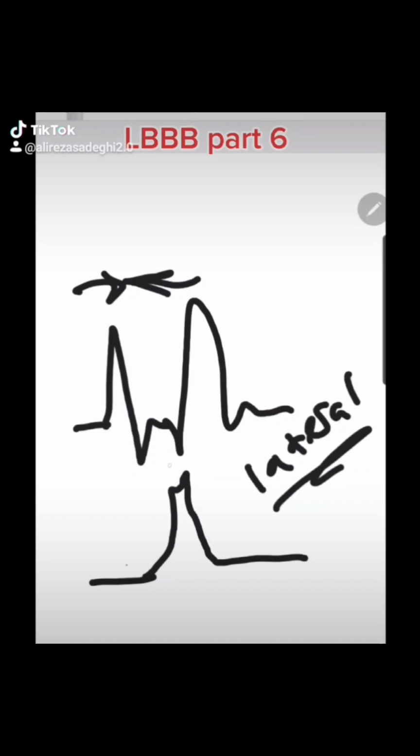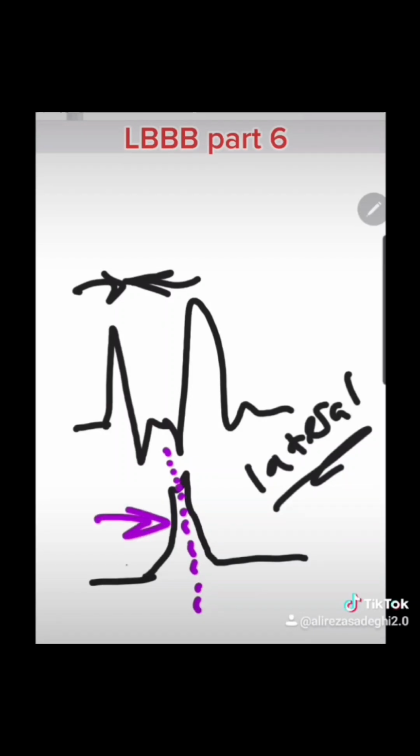Okay? And the first part of this would be the right ventricle depolarizing, and the second part would be the left ventricle depolarizing.